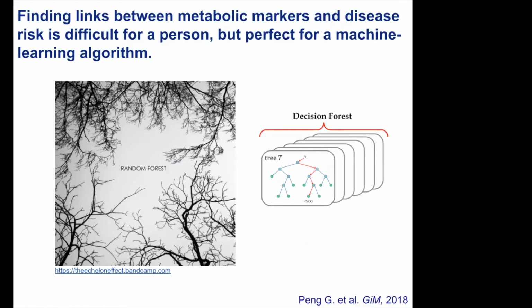Random forest or random decision forests are very powerful tree-based methods for supervised machine learning that have been developed for high-throughput genomic and metabolomic data analysis. We have recently shown an analysis of tandem mass-spectrometry data obtained from the California Newborn Screening Program using RF, which was able to improve the separation of true and false positive cases for one disease, methylmalonic acidemia.